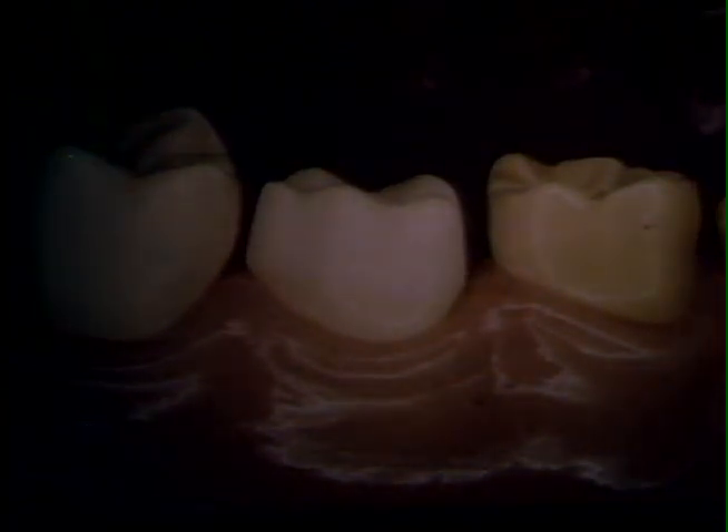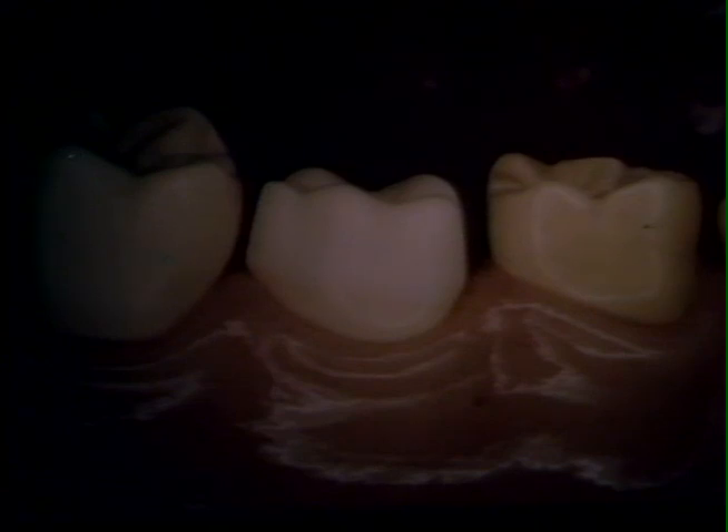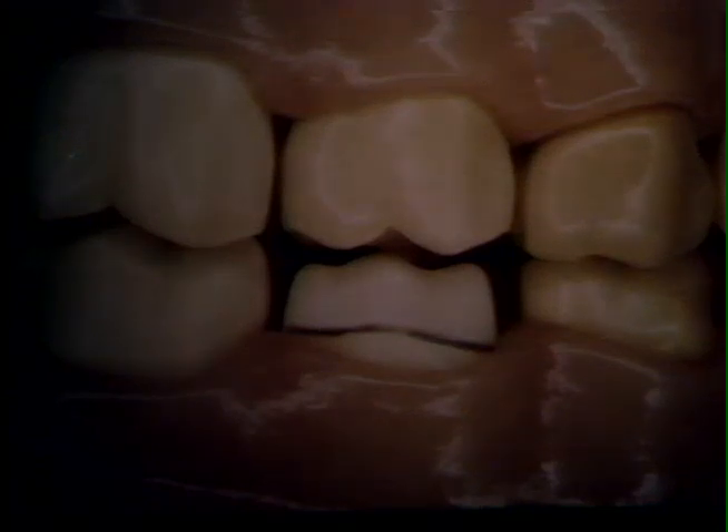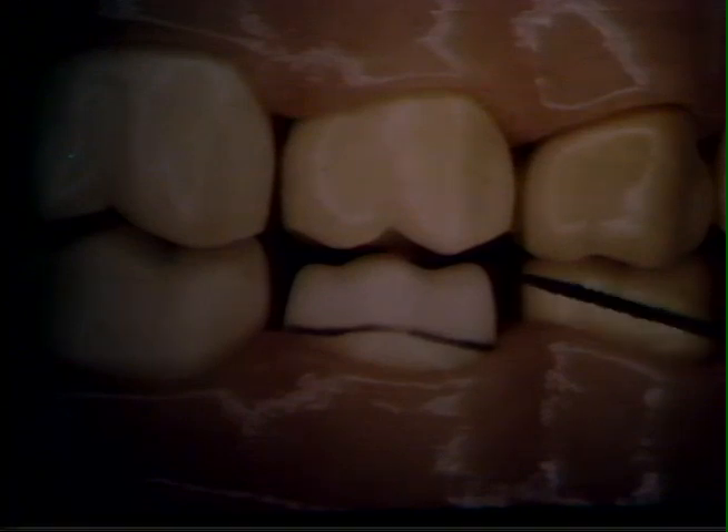These next two slides are simply different views of the finished preparation as it would appear in the arch. Your final preparation should look like this: one millimeter reduction on the occlusal and sufficient mesial distal reduction — remember, enough to pass an explorer.